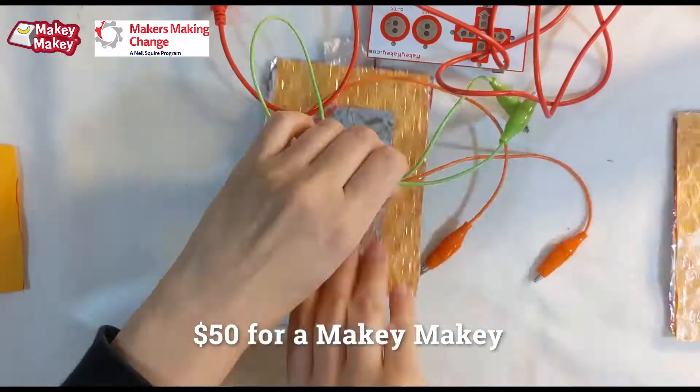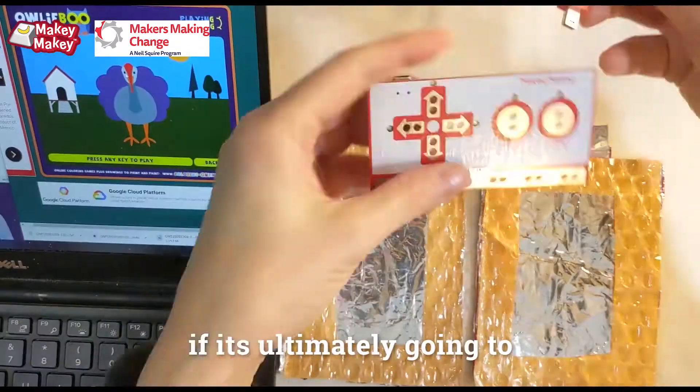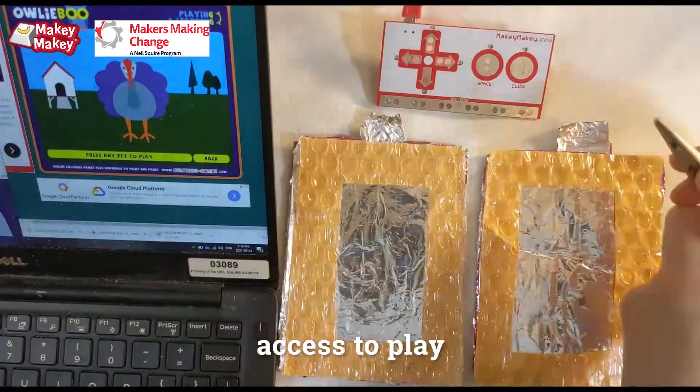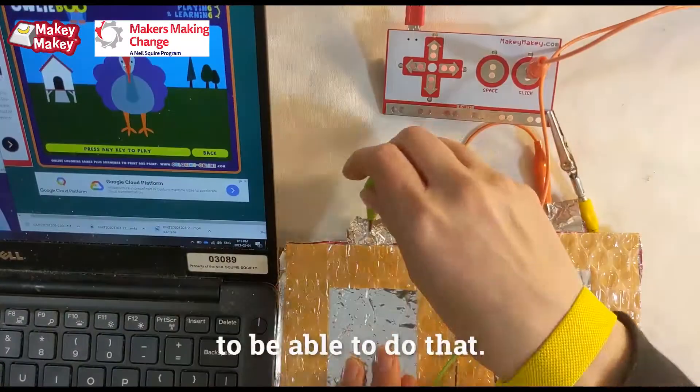For families in that waiting game of getting assistive technology, $50 for a Makey Makey and some cardboard and bubble wrap — if it's ultimately going to allow them access to the computer, access to games, access to play — it's a great tool to be able to do that.